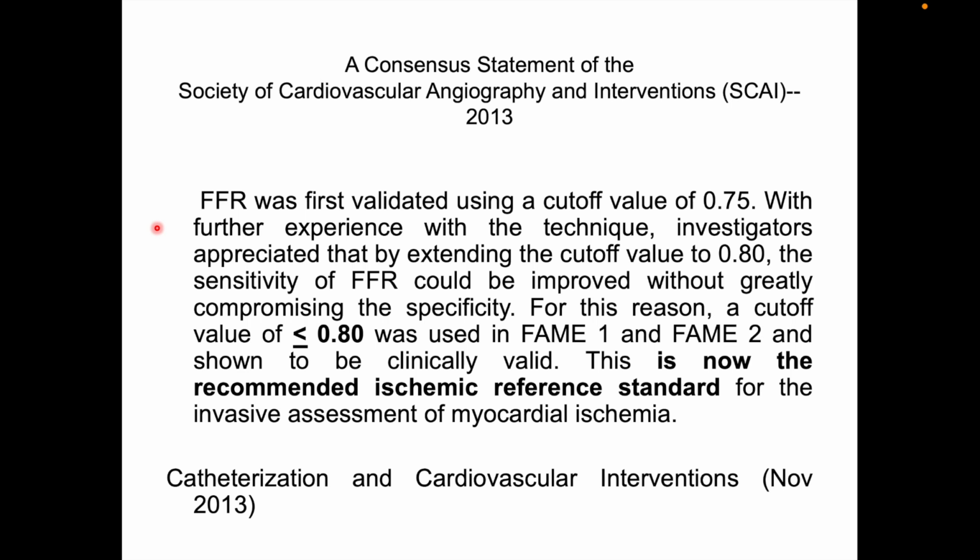For this reason, a cutoff value of less than or equal to 0.80 was used in FAME 1 and FAME 2 and shown to be clinically valid. This is now the recommended ischemic reference standard for the invasive assessment of myocardial ischemia. So now the cutoff value that you use for FFR is not 0.75, but it is 0.80 or less for significance, and anything more than 0.80 is functionally non-significant.